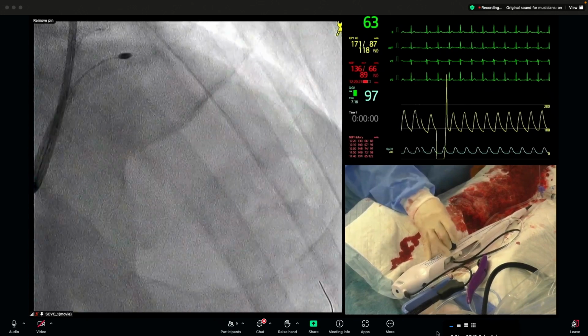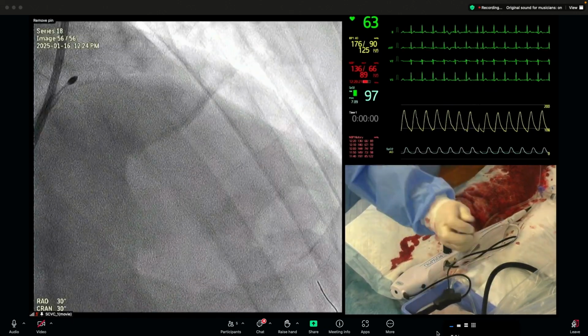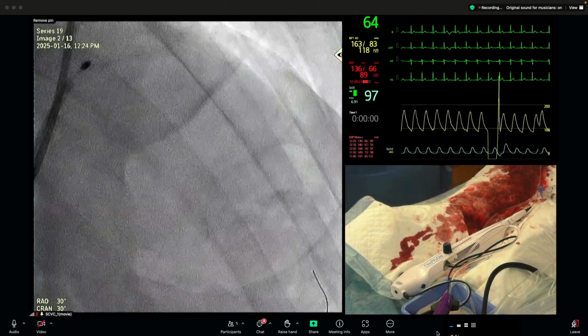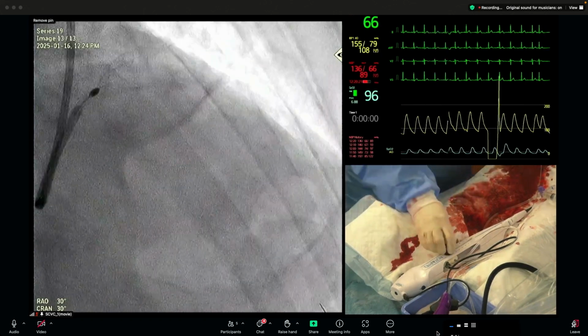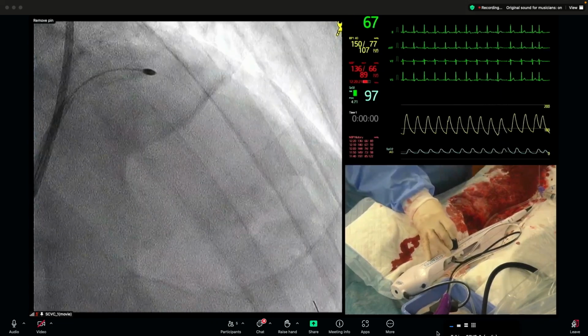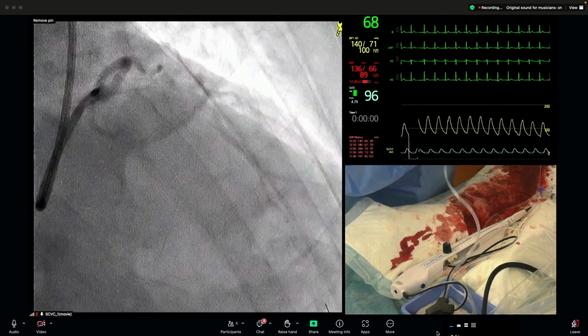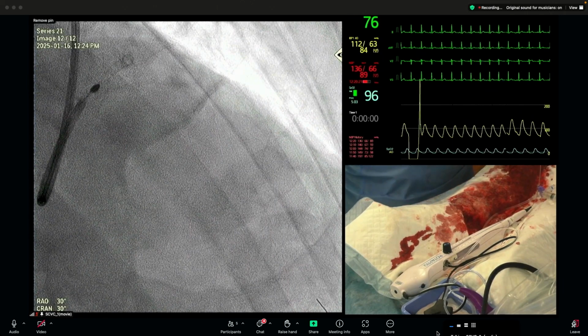As you know, recent imaging trials, such as RENOVATE-COMPLEX-PCI, and a lot of trials show that stent expansion is the most important predictor of outcome. So I agree with you on using a higher burr-to-artery ratio, near 0.5. In this case rotablation is not helpful to facilitate the procedure, but I believe that it facilitates stent expansion. Of course, I'm not sure it is related to clinical outcome in the end.